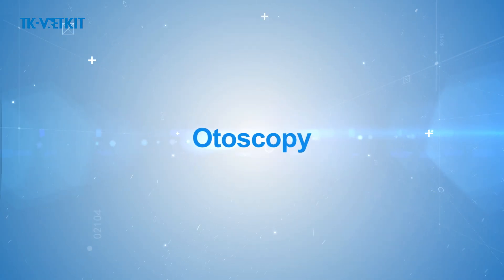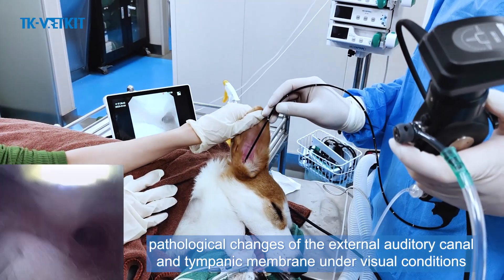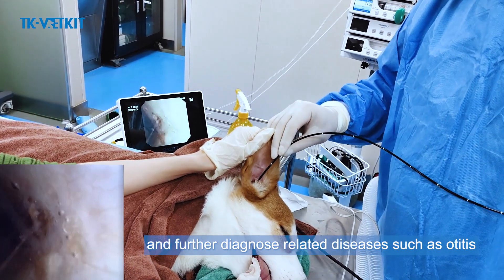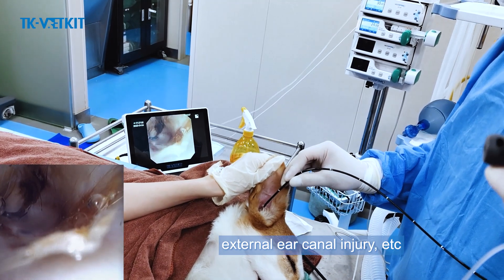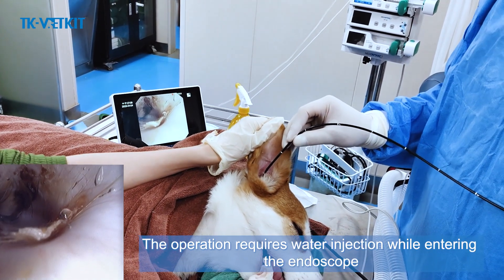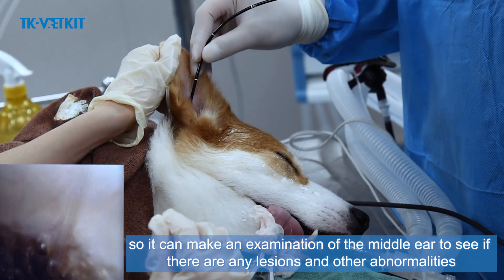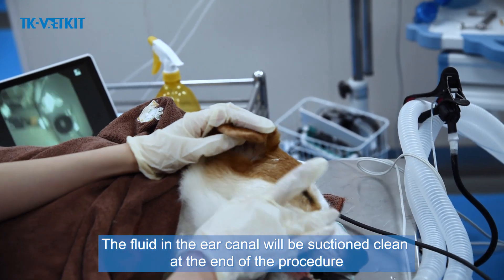Otoscopy examination is mainly to observe the physiological and pathological changes of the external auditory canal and tympanic membrane under visual conditions. It can also grasp foreign bodies or clamp lesions for pathological analysis, and diagnose diseases such as otitis, tympanic membrane perforation, foreign bodies in the external ear canal, and external ear canal injury. Water injection is required while entering the endoscope, and ear canal secretions can be rinsed repeatedly. The TK VetKit small animal endoscope has a slim body enabling examination of the middle ear. Fluid in the ear canal is suctioned clean at the end of the procedure.